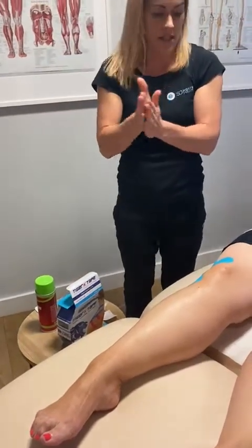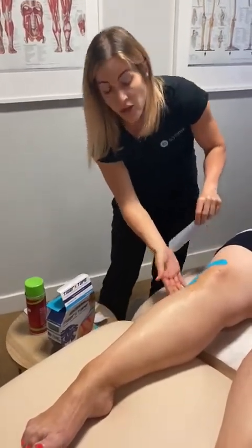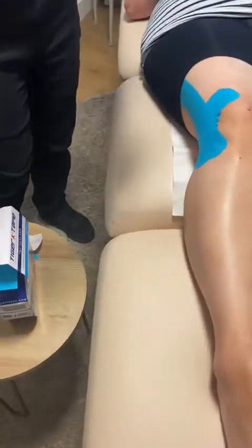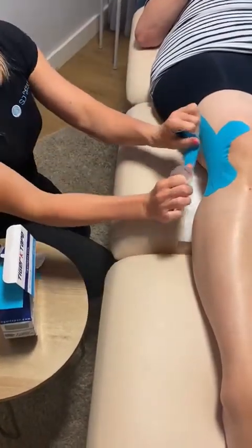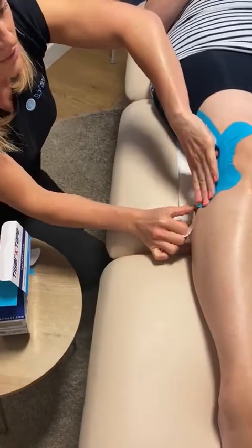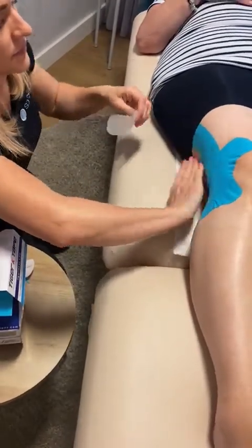So again, warming the tape in your hands. And this time we're going to do the same, but we're going to arc the opposite way. So just peeling this time in the middle. So there you go. And popping the tape down over the top, making an arc with the outside. Okay, so just pushing that down, smoothing it down. So again over the top, and then just up and out.